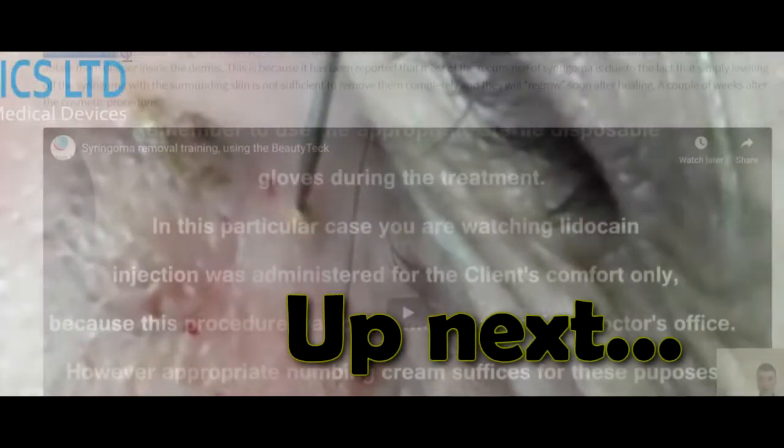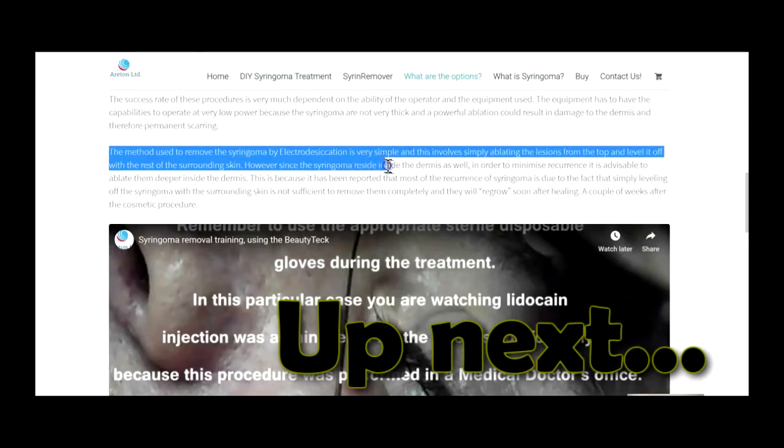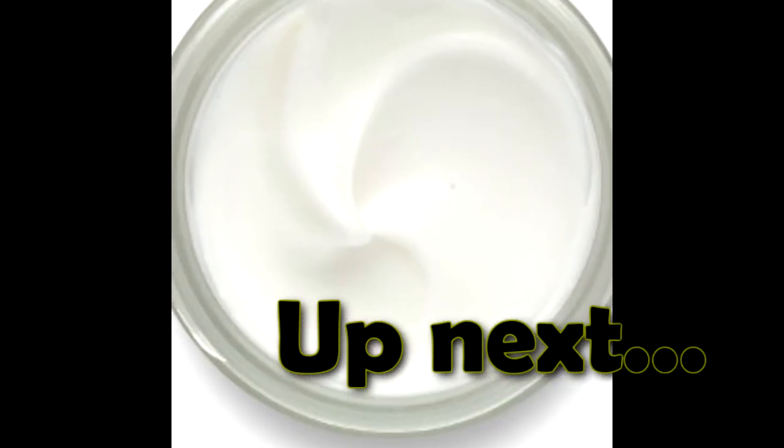The method used to remove syringoma by electrodesiccation is very simple and involves ablating the lesions. Syringoma can be removed by using electrical arcing.